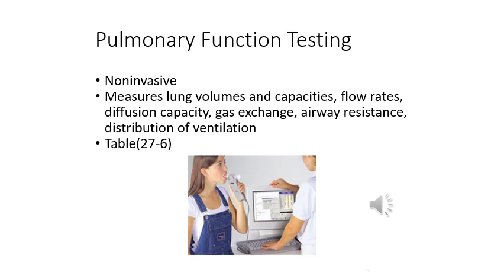Indications for a pulmonary function test would be to determine the cause of dyspnea, screen at-risk patients for lung disease prior to them starting to have symptoms, monitor patients with established respiratory disease, assess response to certain therapies, determine extent of dysfunction, and then pre-surgical screening for patients undergoing thoracic and upper abdominal surgeries.